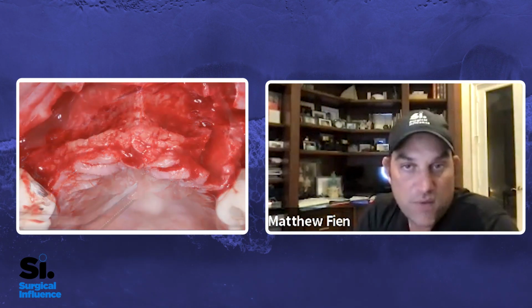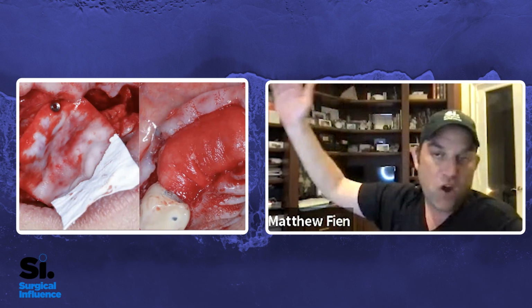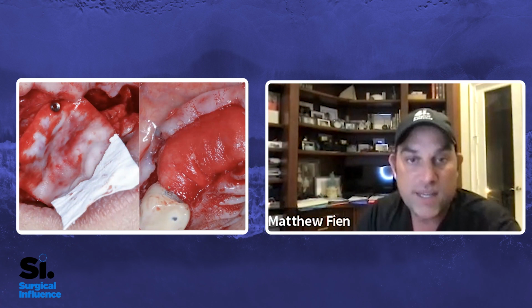So one of the things I learned from Istvan Urban is, why don't you just turn it into 2 easy surgeries, right? So rather than trying to make a membrane that will reach all the way across and have to get everything stable at one time, and feeling like the bone graft is just kind of falling off the sides here, I treat it as 2 completely separate defects.